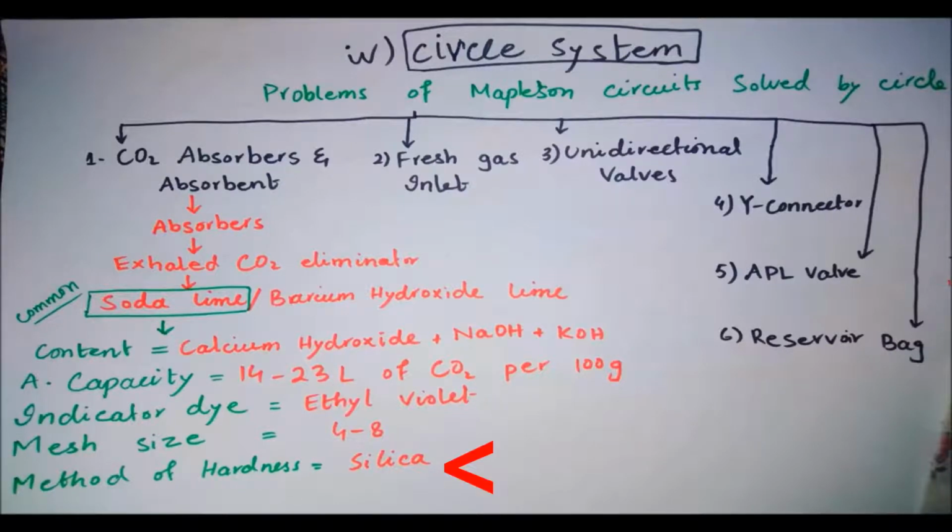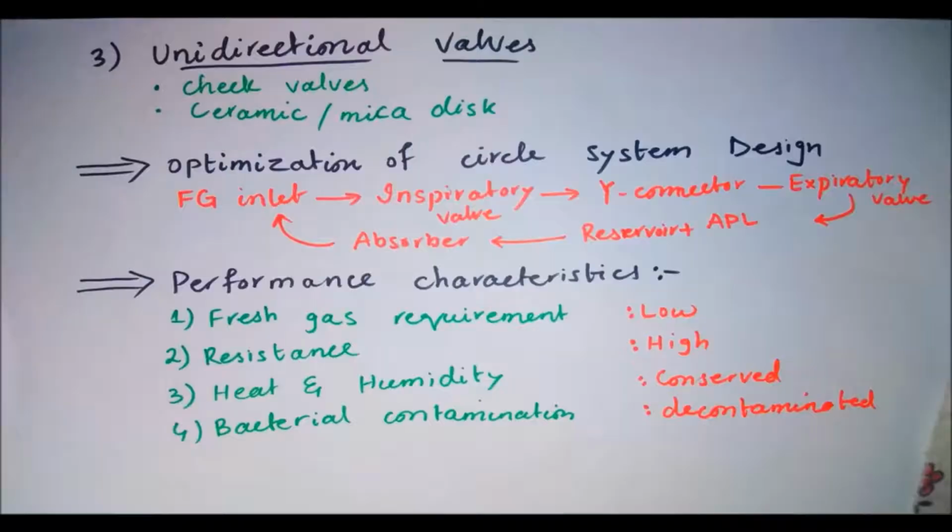Hydroxide salts of soda lime can irritate the skin or mucous membranes, so that's why they are hardened by adding silica to minimize inhalation of sodium hydroxide dust.